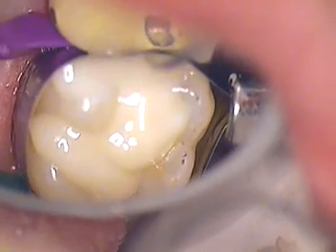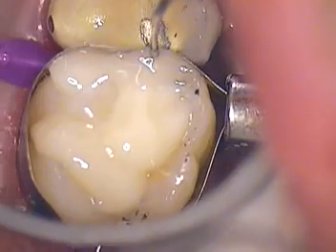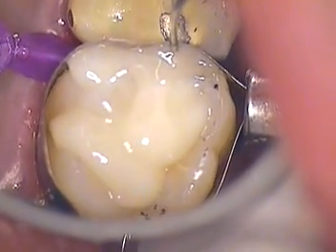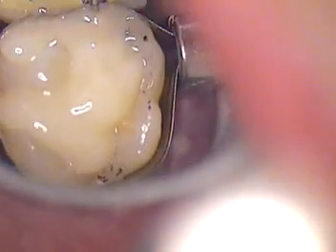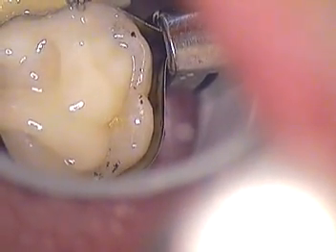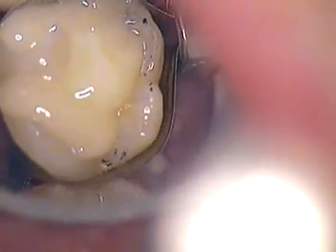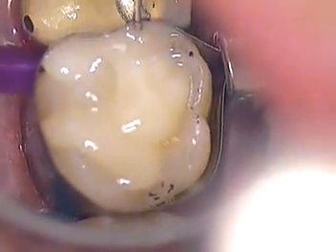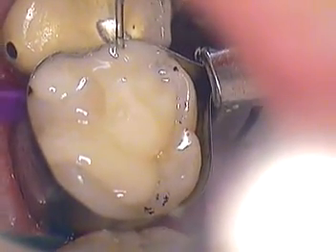I'm just going to hold that contact — open up just a little bit wider, slide that out for me. The only thing is I don't know how long it's going to take this material to set, so we'll let it go another half a minute or so.